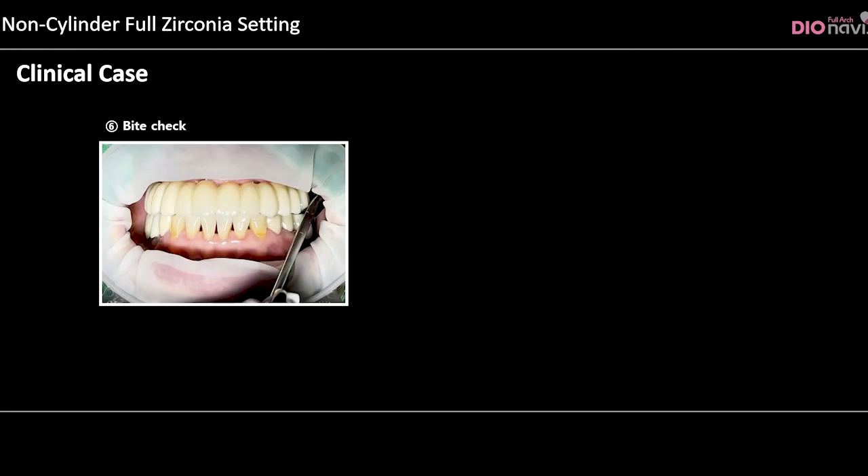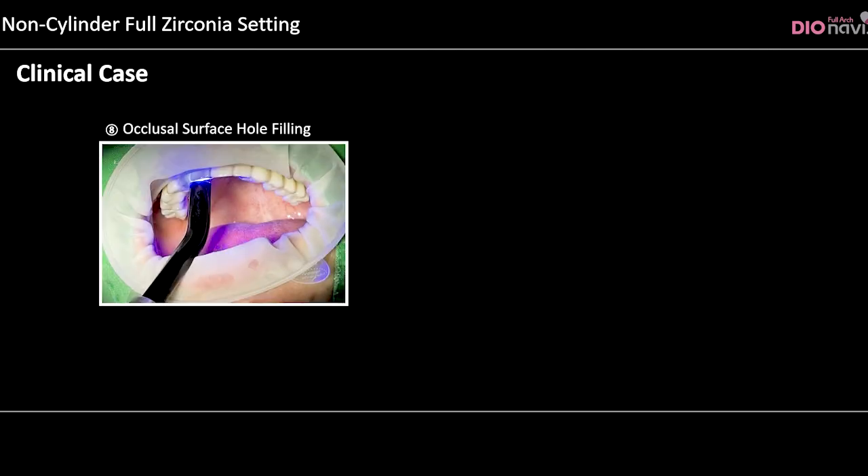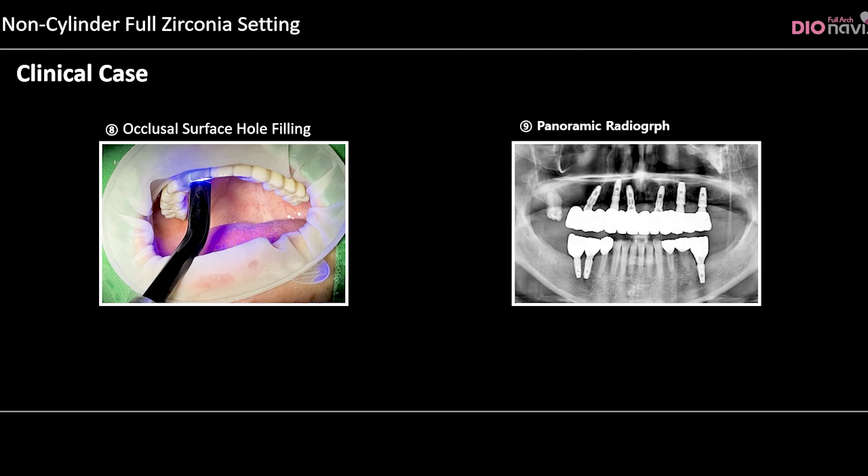After the occlusion check is completed, the holes in the restoration are plugged using Teflon. The restoration holes are further filled with resin and light curing is performed. The state of the restoration connection is confirmed through a panoramic radiograph.